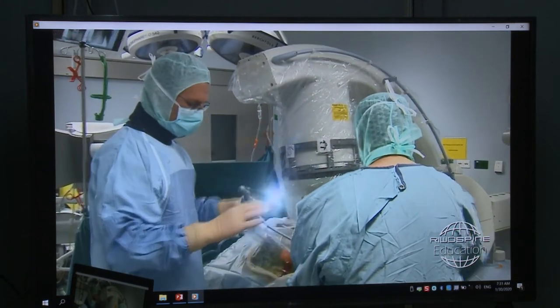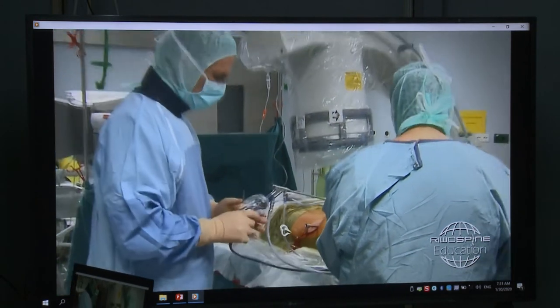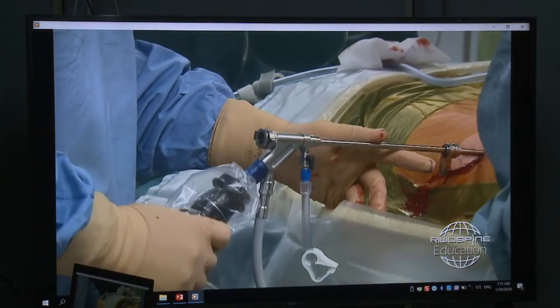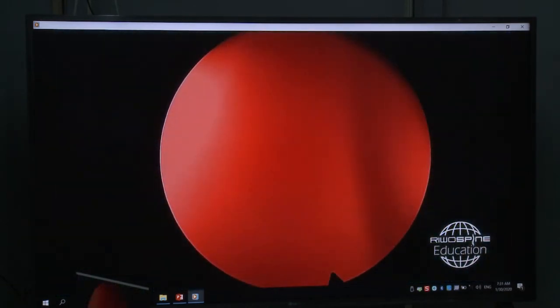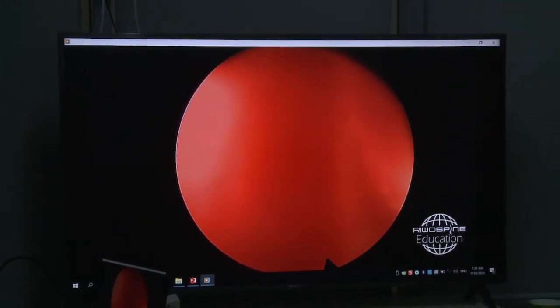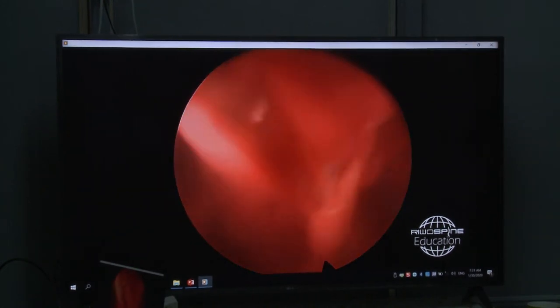Okay. The endoscope, you can see it in the booth and in the practical part. So I just introduce now the endoscope. The same shape, but longer. First, we have to clear the visualization a little bit.